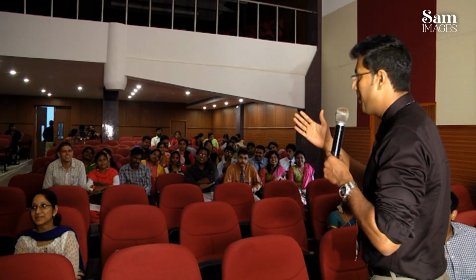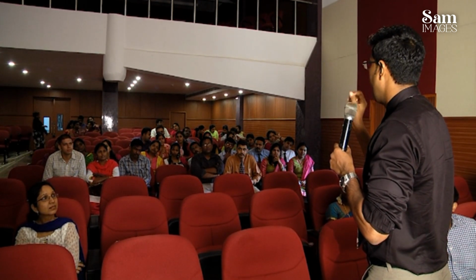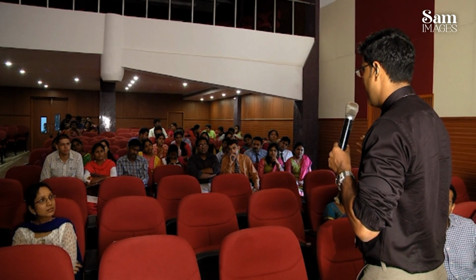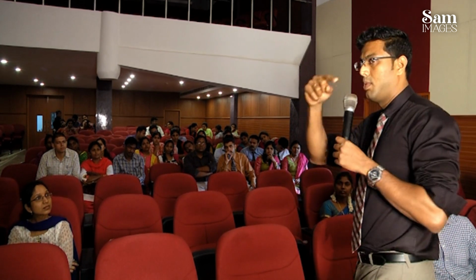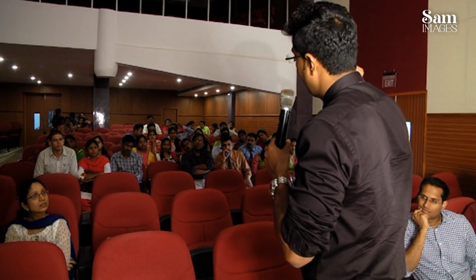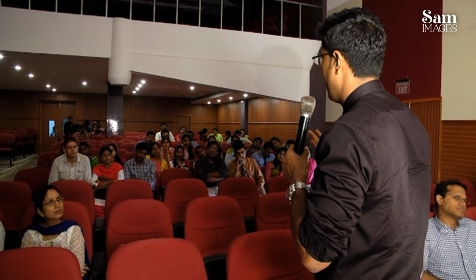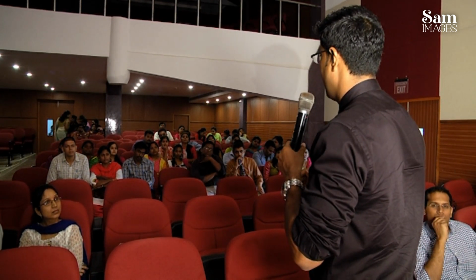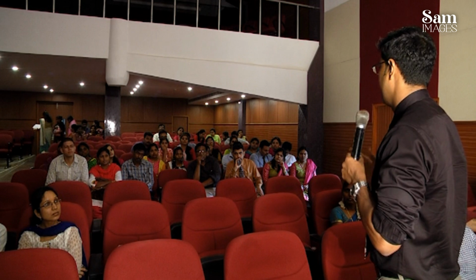Okay. So recent papers have come where you can actually put a very low frequency probe on the tooth and image the pulp space. Two or three papers have come where we actually tried that, with a very low frequency probe, not this probe, I showed you the curvilinear probe there, right? So using a lower frequency, you're able to get slightly better penetration, and you're able to barely visualize the pulp space. To do more work on that, we need much lower frequency probes, maybe special probes with a special frequency so that you can image that. That's the answer to how ultrasound can actually penetrate in certain areas.